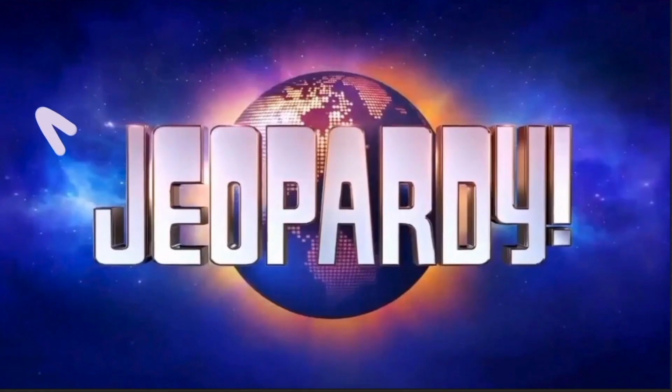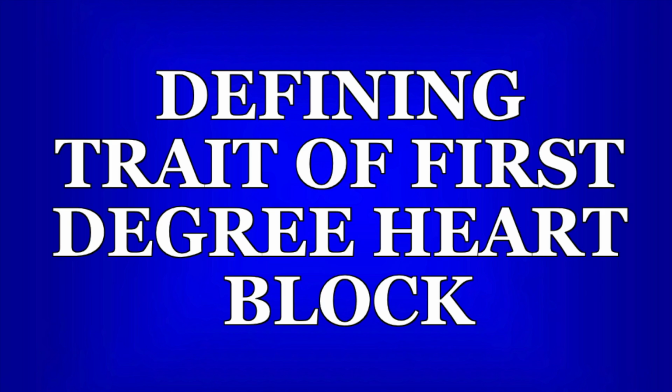Now it's time for NPT Jeopardy! Pause the video now if you want time to read and think about the question. Otherwise, you've got 5, 4, 3, 2, 1.